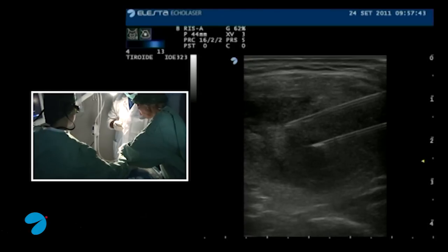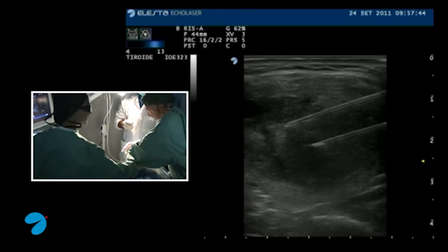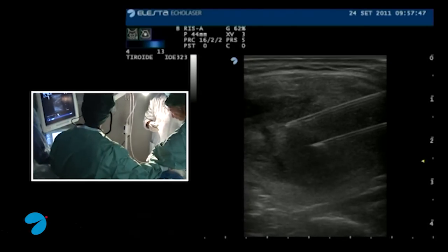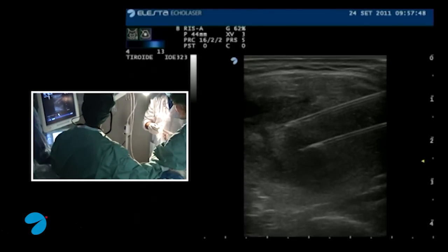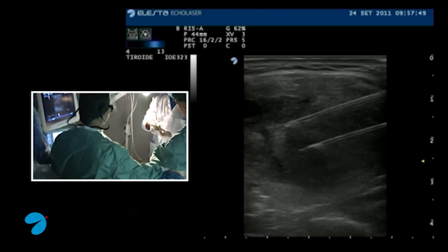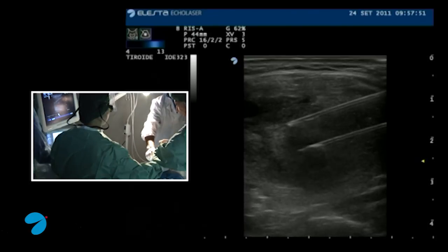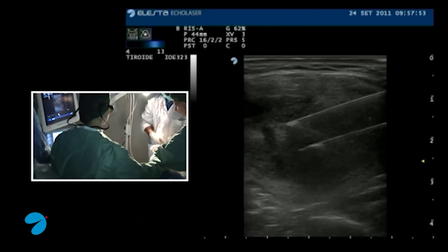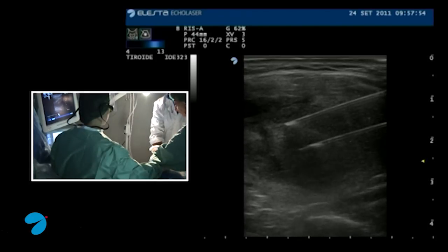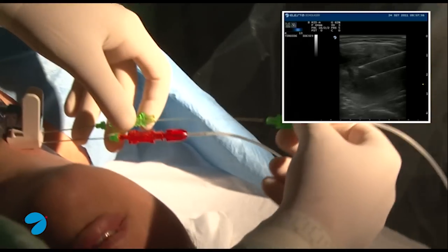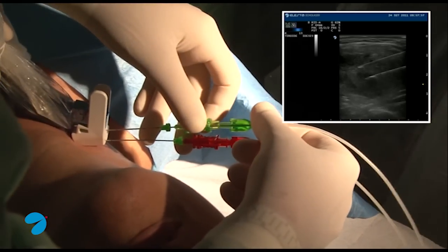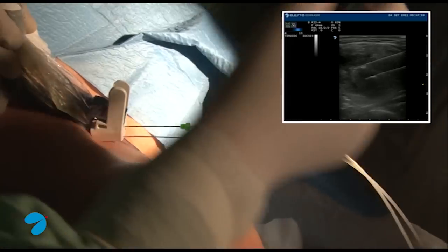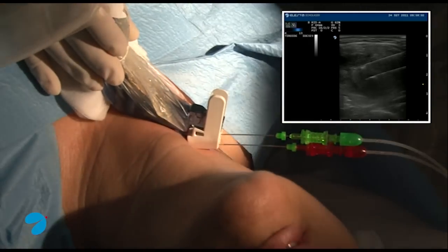Now we are inserting optical fibres in the needles. We proceed to insert the first fibre in the lower needle and the second in the upper needle. After the insertion, we evaluate the fibre tip position in the nodule.